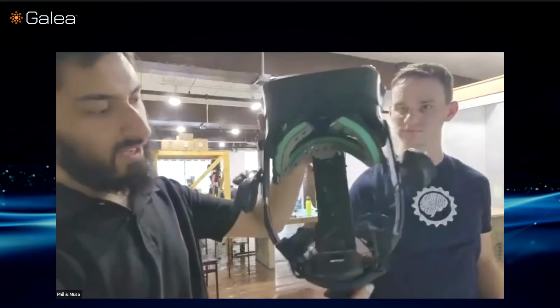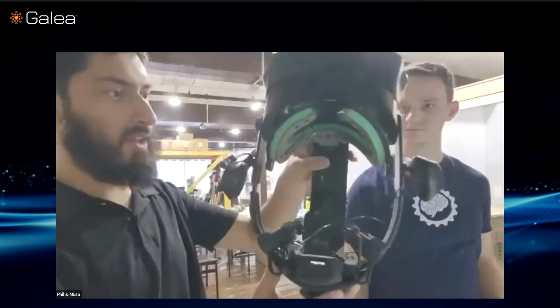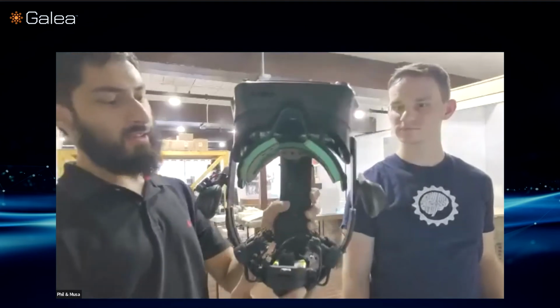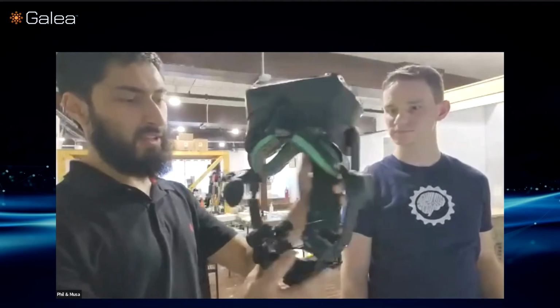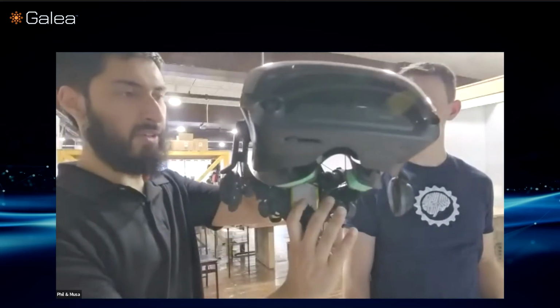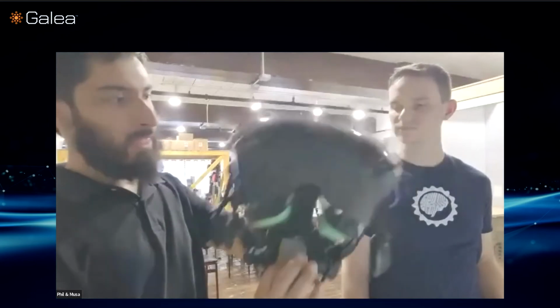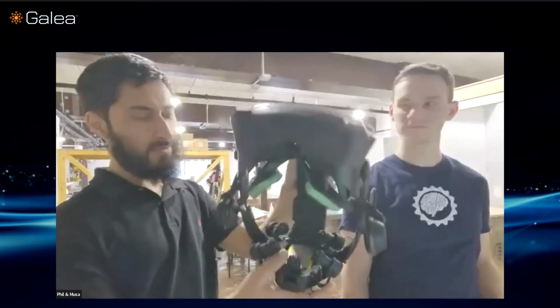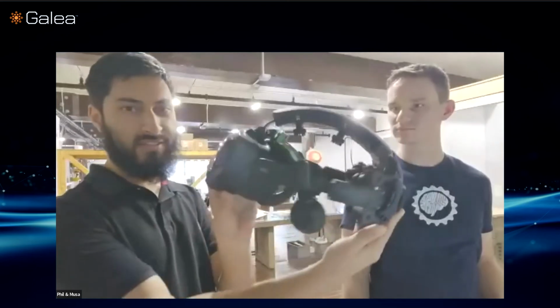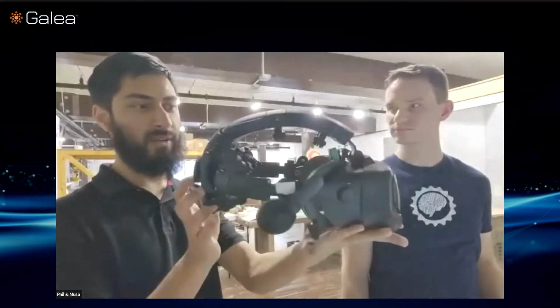If you look at the spine of the device, we have these rubberized electrodes for contacting the scalp through the hair. These electrodes are placed in a certain orientation, so you get all the central information, but you also have a lot of occipital lobe information. So this is basically an overview of the device. It's not finalized just yet, but this is a good preview of what's coming. And I think you can take it from here to demonstrate the Unity environment.